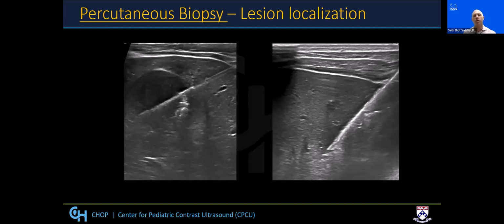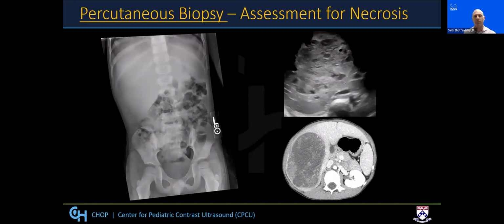So this case shows the benefit in lesion location, and it also shows the value that localizing that more subtle, smaller lesion and sampling it was able to confirm that not just the single lesion, but the multiple lesions were all related to the same underlying pathology.